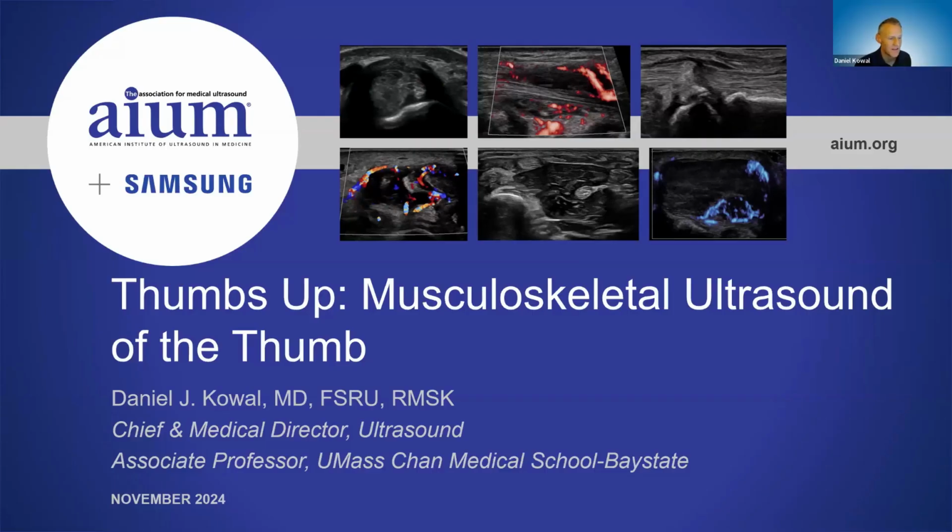Someone mentioned that they do not have a hockey stick probe, but they have a linear probe. You can actually get away with a larger footprint linear probe with the thumb. The hockey stick is really helpful for getting that small footprint, but especially if you use a lot of gel, an 18 or even a 14, you can see a tremendous amount of detail, including the pulleys and some of the finer elements. So while a hockey stick is very helpful, it's not essential.